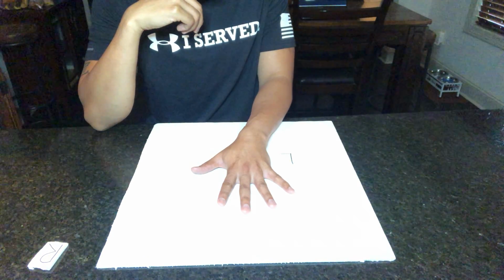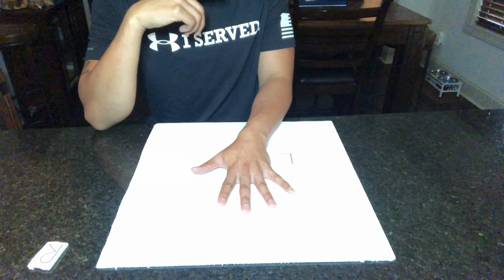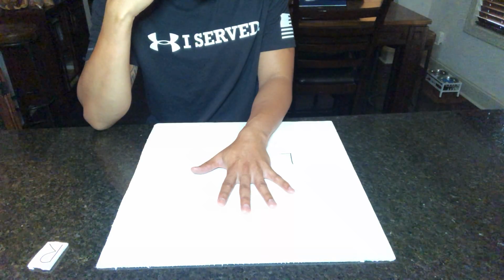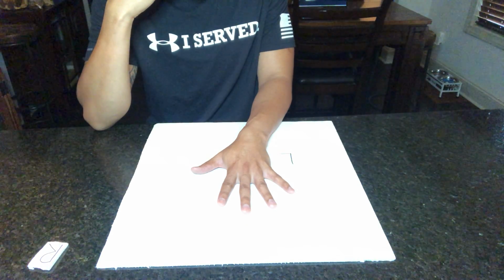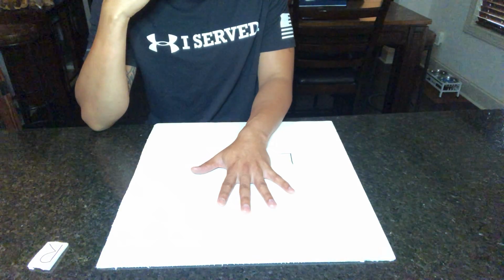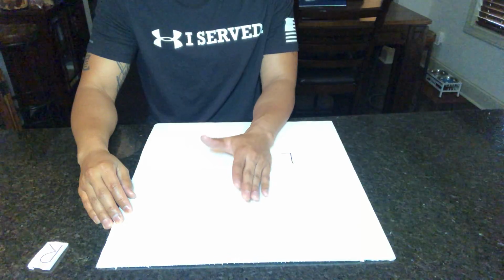We're going to instruct the patient to don't breathe, don't move, and we can place a shield on their lap to protect from radiation. So that's the PA hand projection. Now we're going to move over to the oblique hand projection.